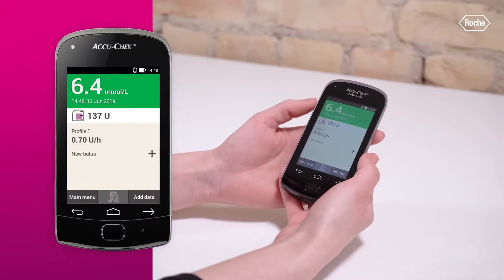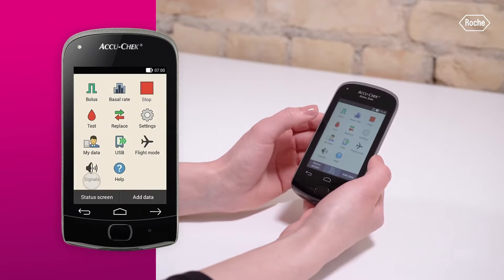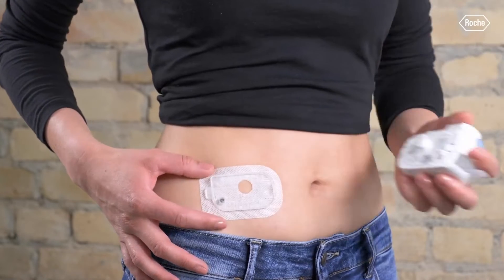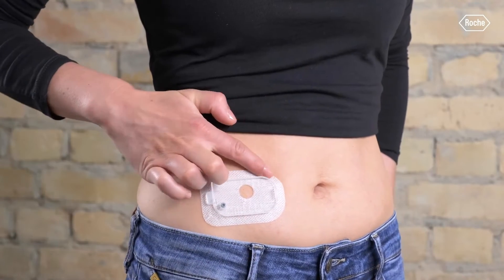The next device you'll have is the PDM. This is what's used to create settings for the pump and control it, unless you're using those quick bolus buttons. One of its other reusable parts is the applicator, which lasts up to one full year. This is called the insertion device, and it's what's used to put down an underlay pad onto your body, which the insulin pump clips into.